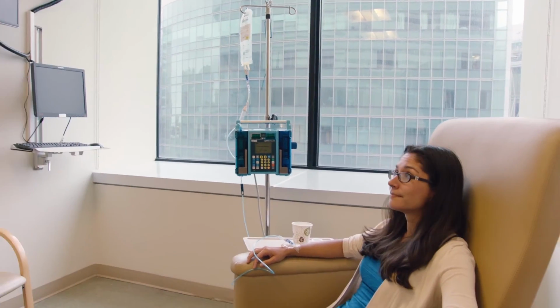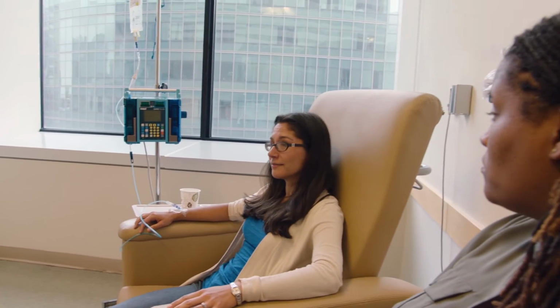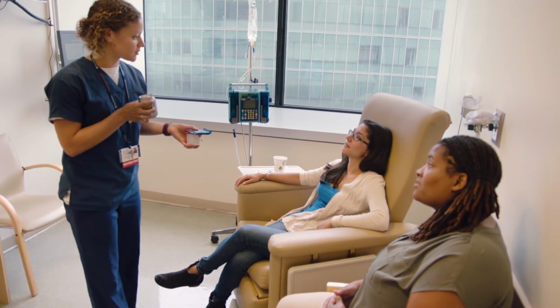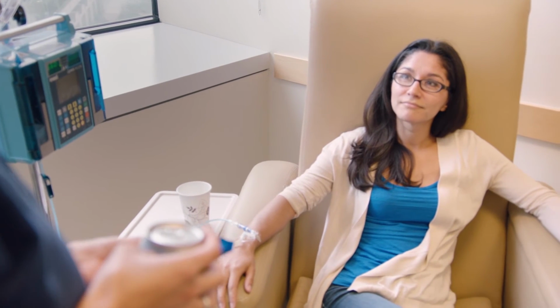The length of time for infusion depends on your unique treatment plan and can take anywhere from 15 minutes to a full day. Certain medications may require that you remain in your infusion room for monitoring after your treatment is complete. Regardless of how long your treatment lasts, your support person can be in your infusion room with you throughout the entire process. Juice and crackers are provided in the infusion suite, but please feel free to bring snacks or meals with you for the day. There are also multiple places to purchase food and drinks throughout the Perlman Center. Remember, you are free to move around within the infusion suite all you like, but for anything outside that area, you'll want to ask your support person to make those purchases and bring them back into the infusion suite.